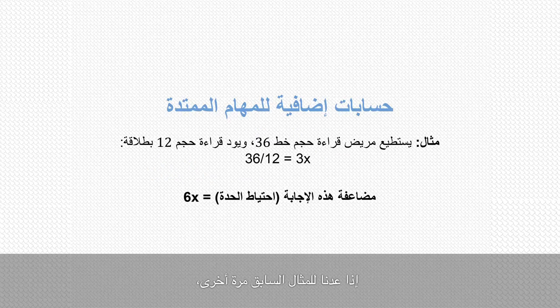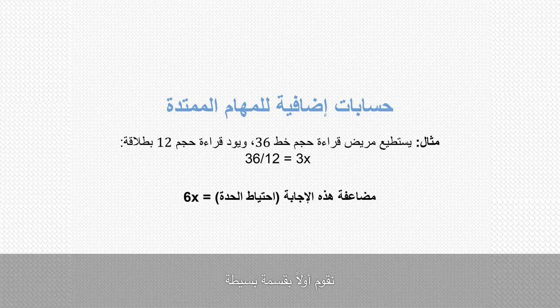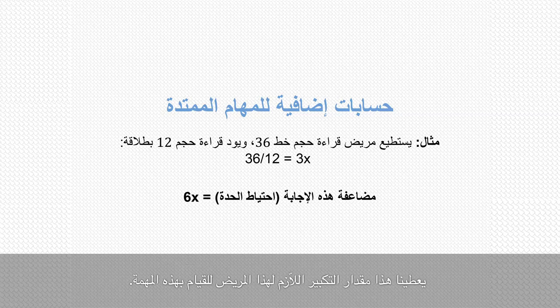So, if we look at our earlier example again, if they can read size font 36 but want to read size 12 in a sustained fashion, we do the simple division sum first. 36 divided by 12 equals 3 times magnification. And to allow an acuity reserve, we double this answer, 3 times 2, so the total answer is 6 times magnification. Now this gives us an estimate of the magnification need for this patient, for this task. This doesn't give us the answer, but it gives us a very good starting point.